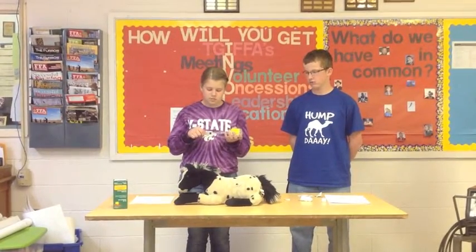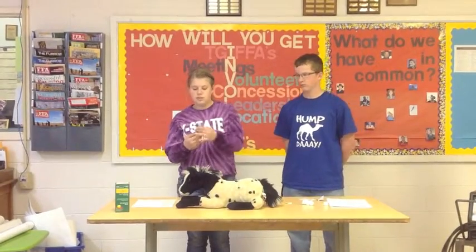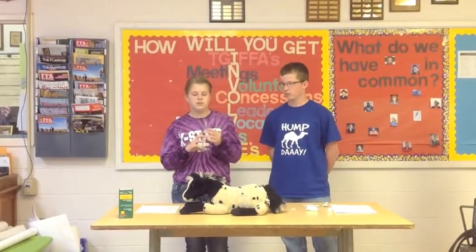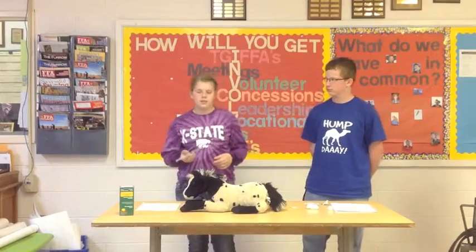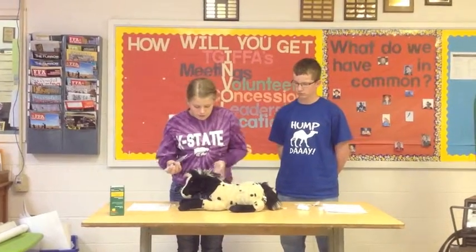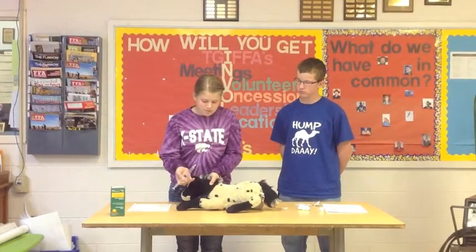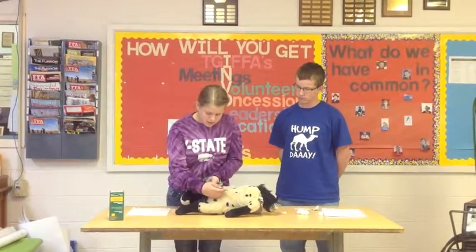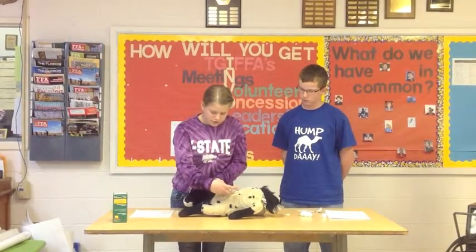which is 11 milliliters. And once you have that measured, you need to push all your air out until liquid comes out the top. And then, in order to get into the vein, you need to hold down your vein until the vein pops out. And then you're going to go into the vein like so, and then push all of your drug in.